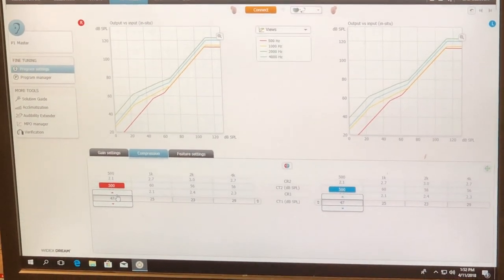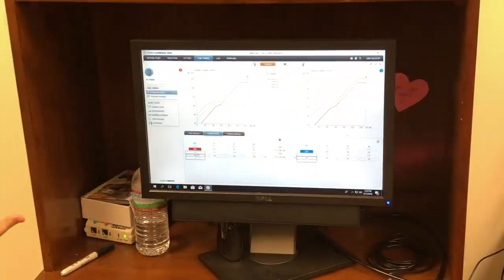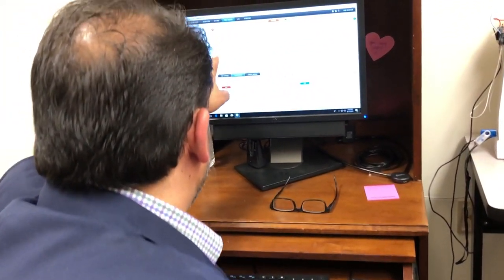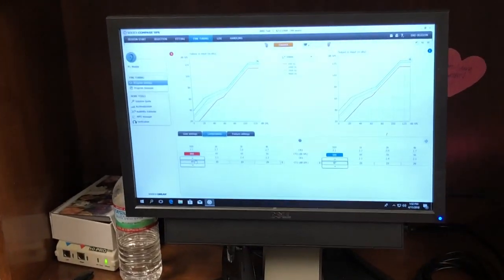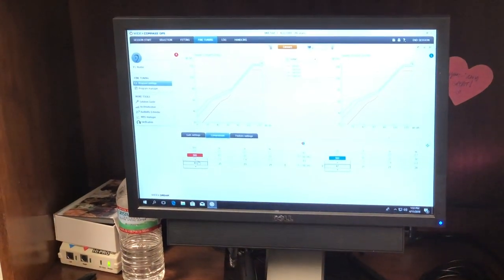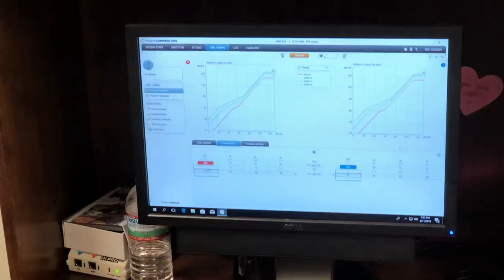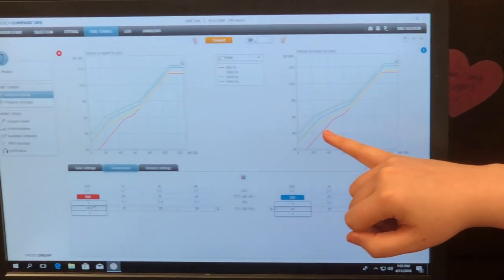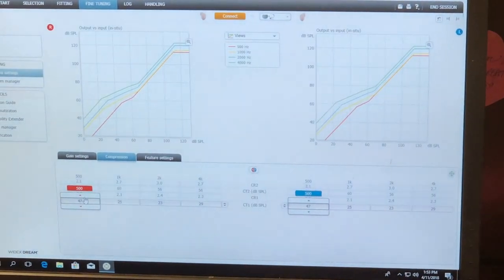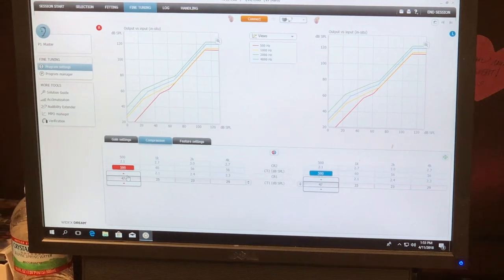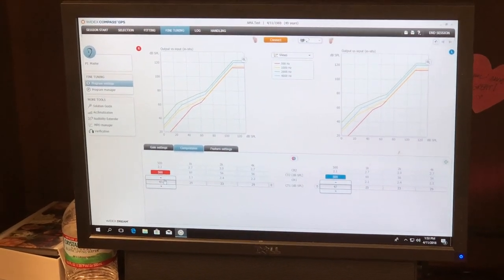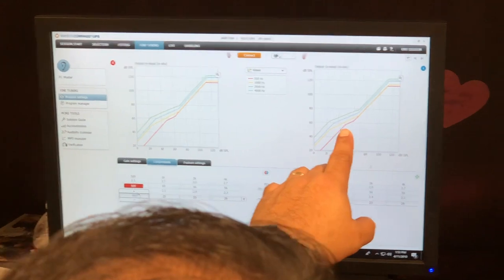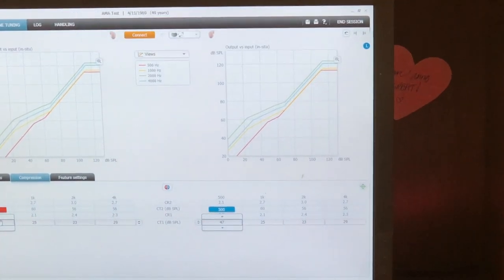The only time you're going to change gain is when you do real ear. They're both gain on both axes, right? So this is output. This is input. Then the difference is the gain. So instead of the knee point being like down here, what it was, now it's up here. And because of that, I've now shifted the tilt on my device.